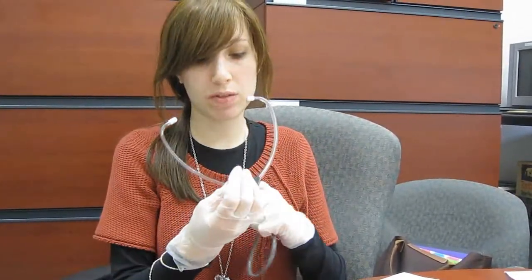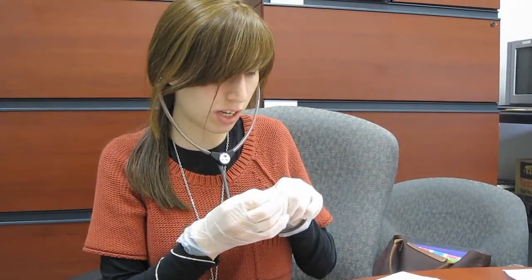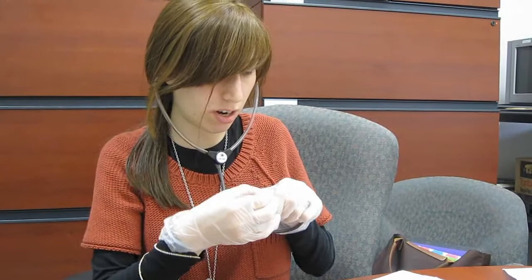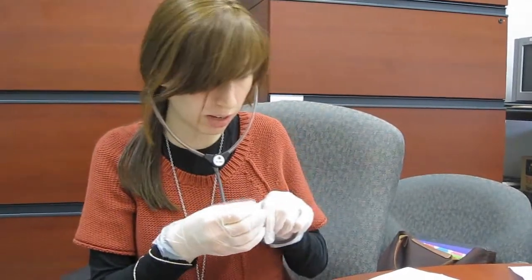We also want to check the volume control, so I'm going to put it back on and put it back in, and just as the hearing gets higher, does it get higher and lower? And it does, so it looks like it's working. Okay.